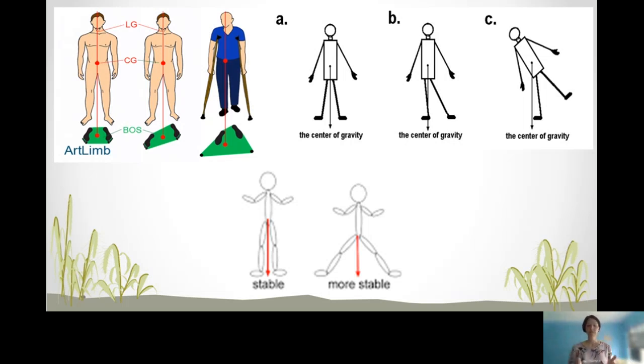Picture at the bottom shows you the stability as you move your legs apart. All right.